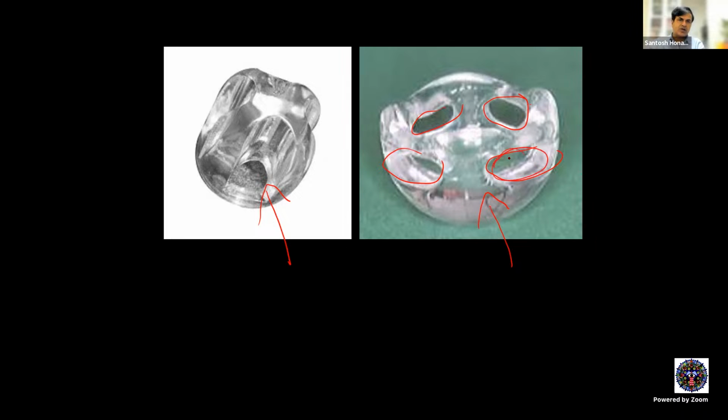These extraocular muscles are simply passed, taken to the other side and sutured. So there is a kind of cross imbrication of extraocular muscles through these holes. So what happens finally? The extraocular muscles will lie like that on top of the implant, right? So the implant will be submerged by the anterior Tenon's and the conjunctiva, correct?